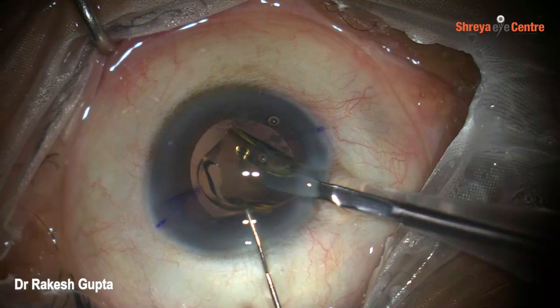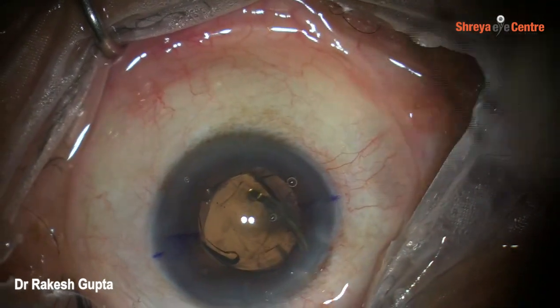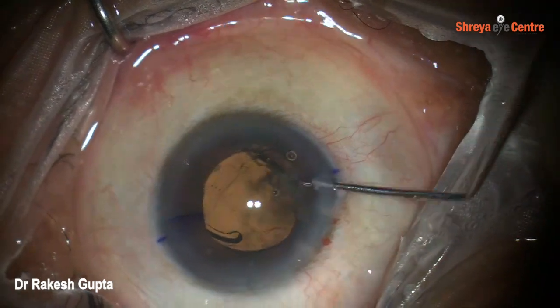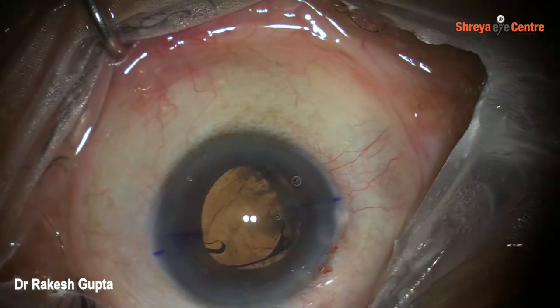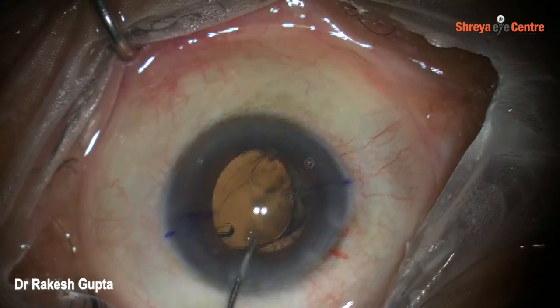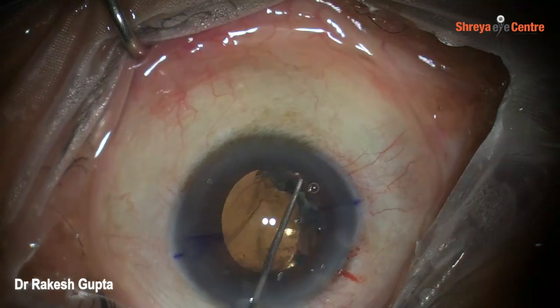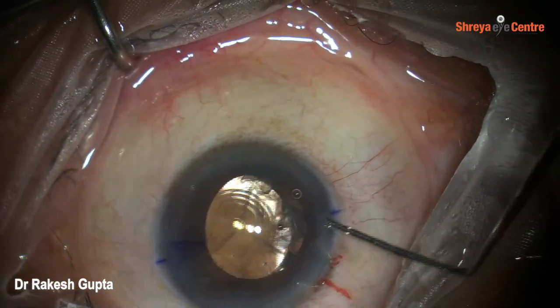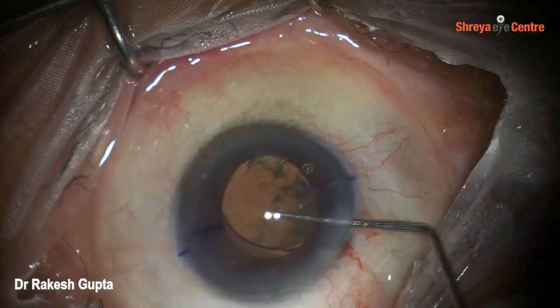This makes it easy to insert the IOL in the bag, and it will also help in rotation of the IOL. Now I am implanting the lens in the bag. Here I am pushing the lens inside. You can see the lower haptic has gone into the bag, and the upper haptic I will be pushing behind the anterior capsule by tucking it. I am being very cautious that I am not rotating my intraocular lens at this point, till the haptic is completely unfolded and has reached the equator of the bag.